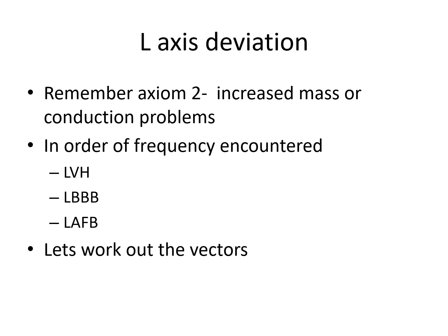So far we have looked at a heart where electricity is going in the usual direction, which is to say left, down, and away from the chest wall and towards the apex. Now let's look at a heart where the axis is deviated towards the left, which is to say the electricity is going up and left. Well, something must have caused the overall vector of depolarization to shift that way.